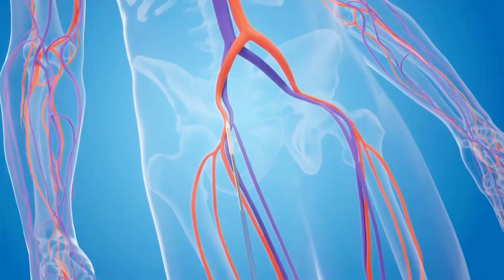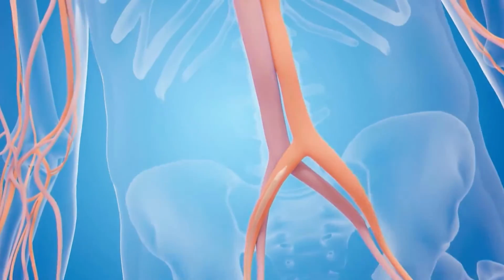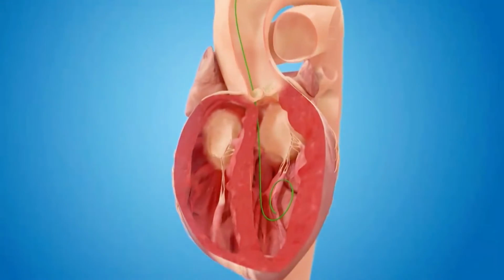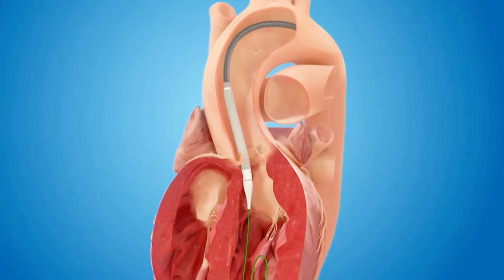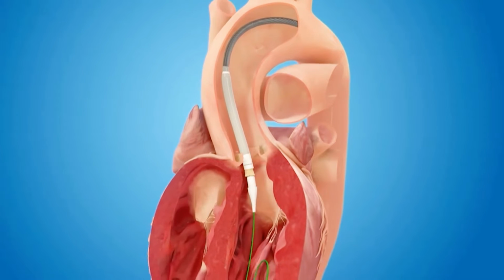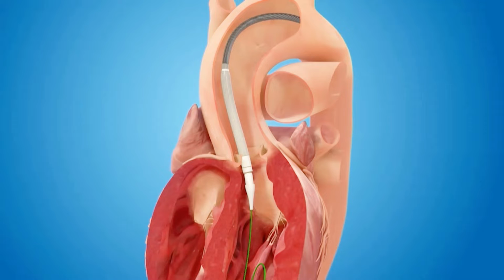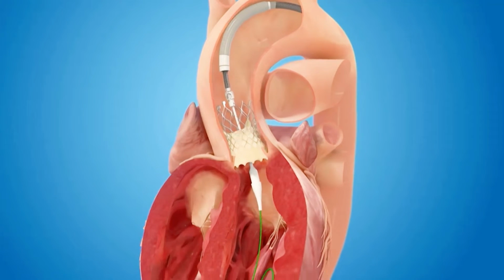of your chest. So here you see the actual catheter with the little valve constrained, like Andreas said, all tightened up in this little tube, which is probably about a 1/6 to 1/8 of an inch in diameter. And here the valve comes across your sick valve. And we back out, and here we can go back and forth like I talked about before until we are absolutely happy where we want it to go. And here is an illustration where we're happy.